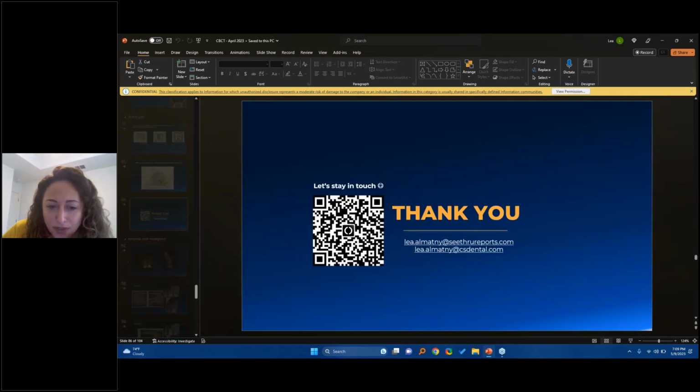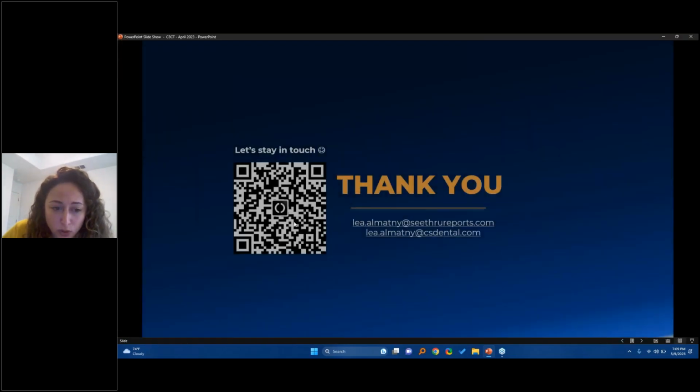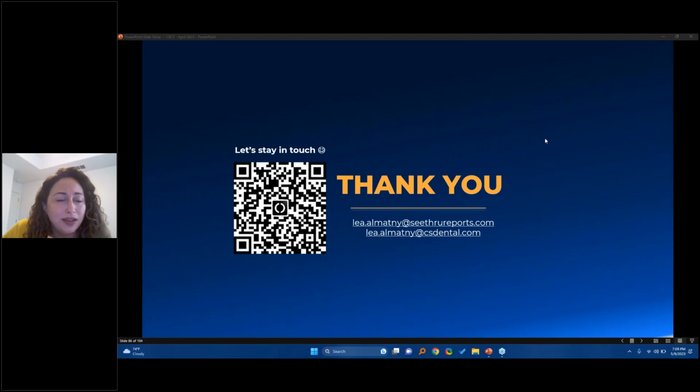There are a lot of videos on YouTube that also show that. If you Google Carestream Phil, or Phil with Carestream, he has a long playlist on how to use the imaging software and how to manipulate your scans efficiently.